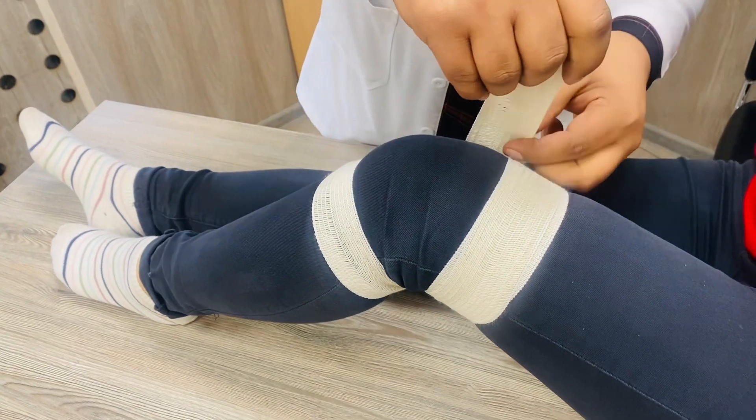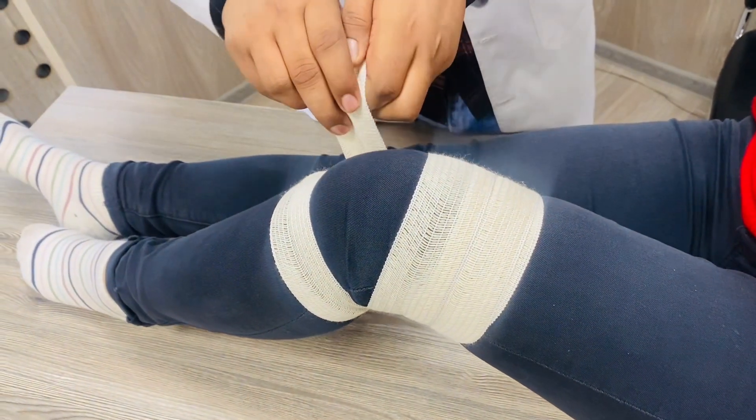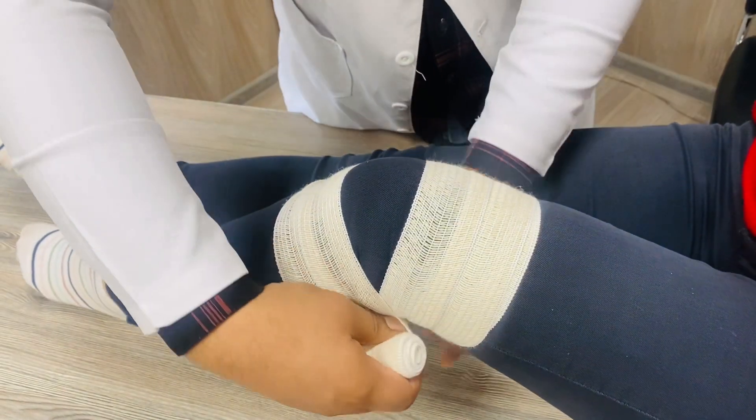One circulation towards the proximal part and one circulation towards the distal part of the body.